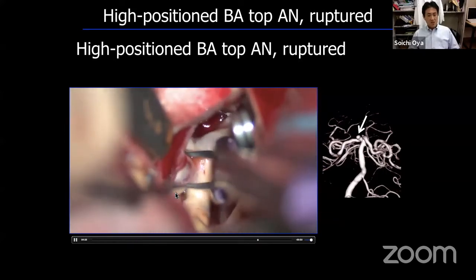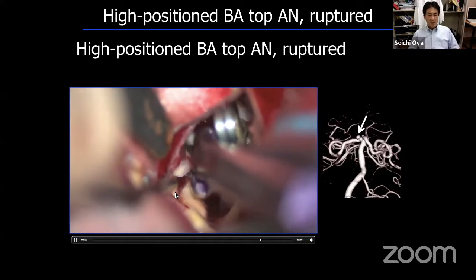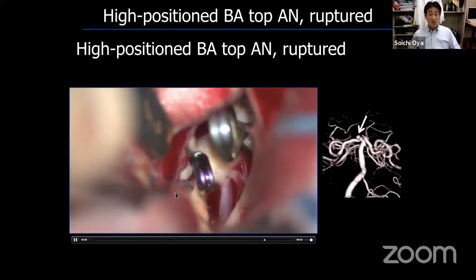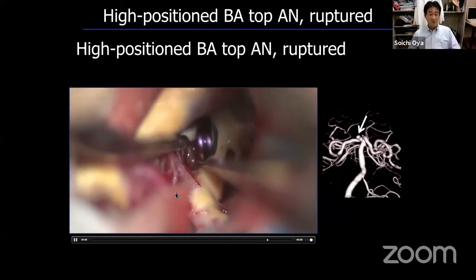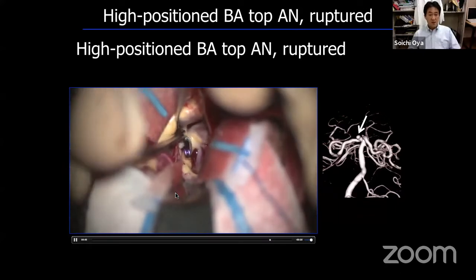And I insert the small mini curved blade clip here. Once you create a wide ample space here, the clipping is not formidable, difficult. The perforators are preserved and they look good.